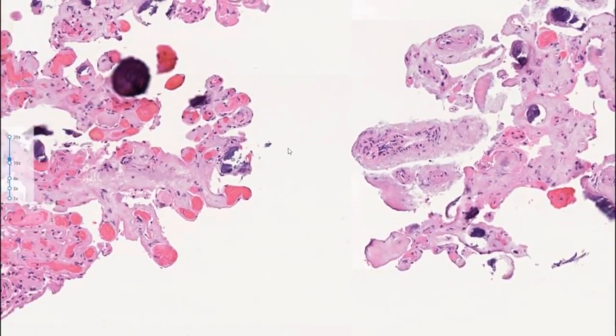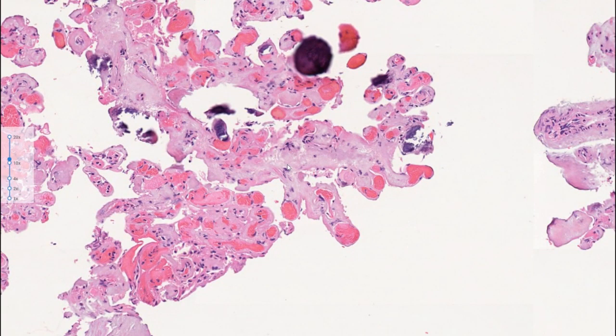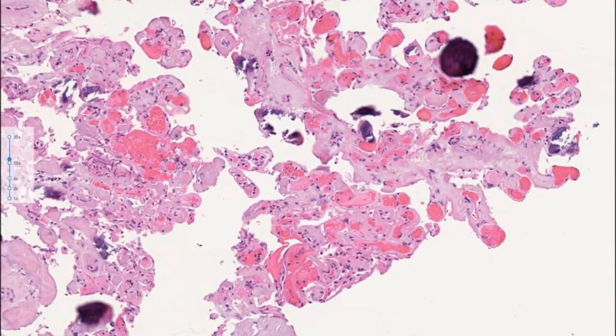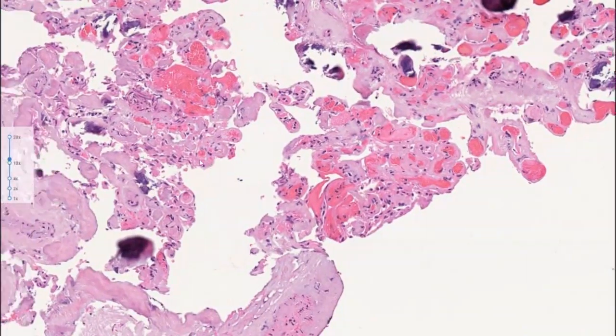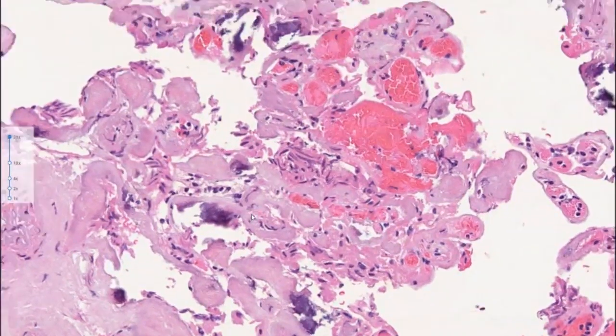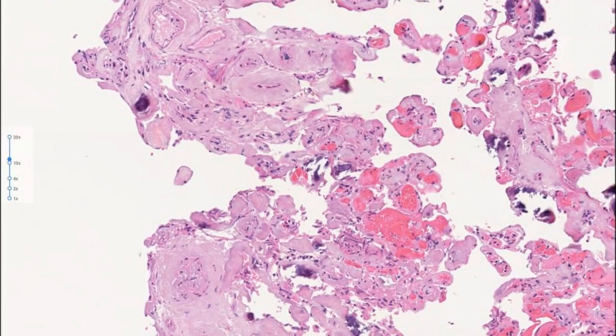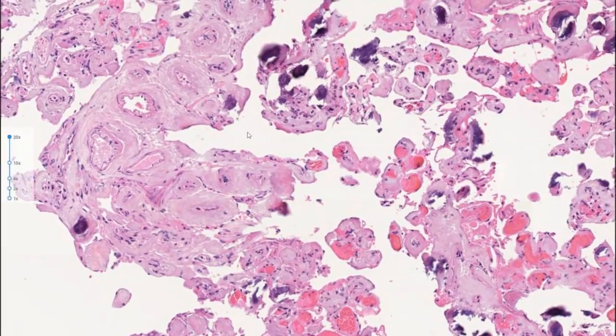Here you have papillae. And again, you have these calcifications. These are very common in choroid plexus epithelium, so something to have in mind. These are areas of hyalinization and calcifications that you see in choroid plexus epithelium, particularly with age. They are frequent incidental findings in CT scans.